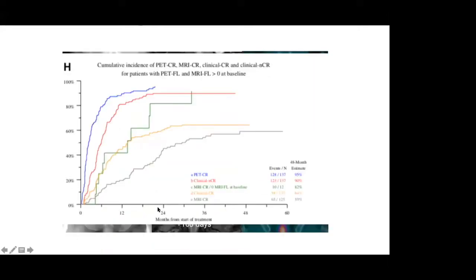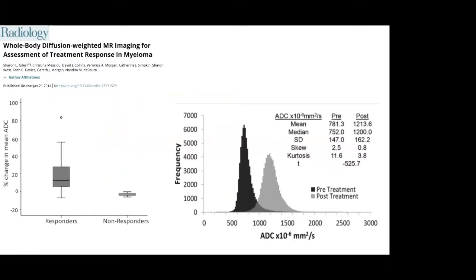And this is also what they saw, and this is a timeline. So this is the months from the start of treatment, and these are the different techniques. So actually, PET can show a complete response much quicker than, for instance, MRI or even a clinical complete response. So it seems that PET-CT is actually a really good technique there.